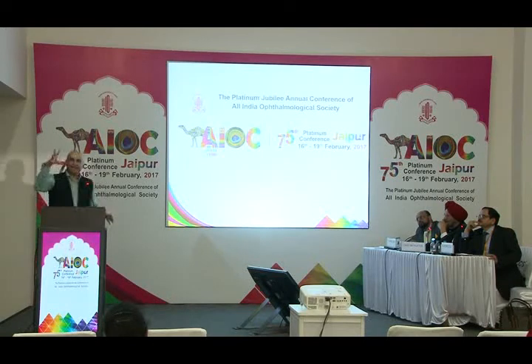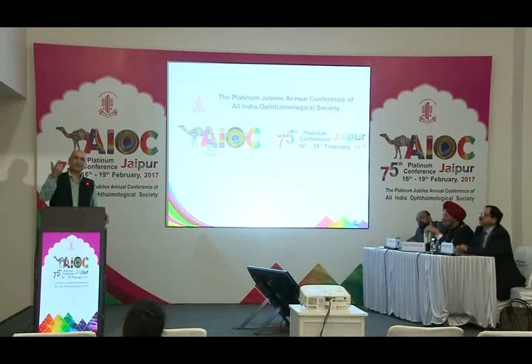So what we did, we dilated the patient for a week and put him on steroids, and the so-called cataract disappeared. So before jumping for explanting, make sure you do an OCT. You will definitely see more opacification of the anterior capsule if it's an anterior polar cataract, and you will see a white blob on top of the crystalline lens if it's retained viscoelastic.